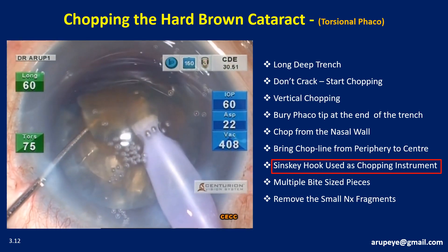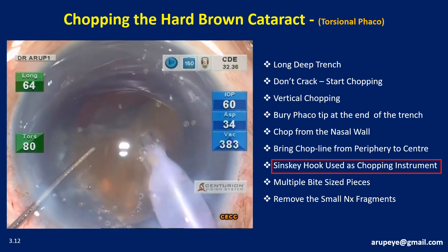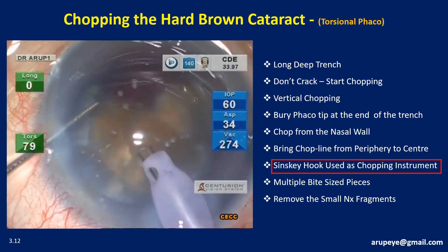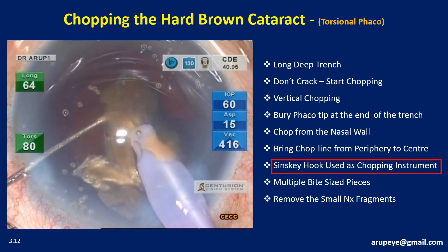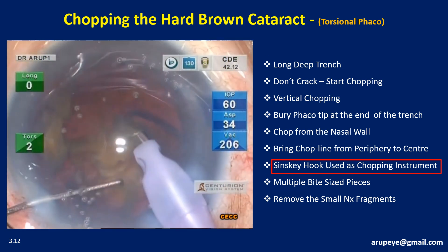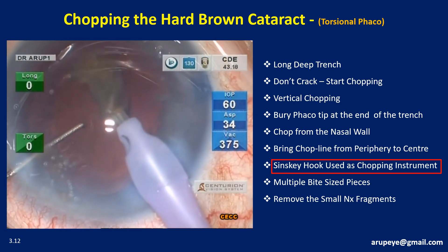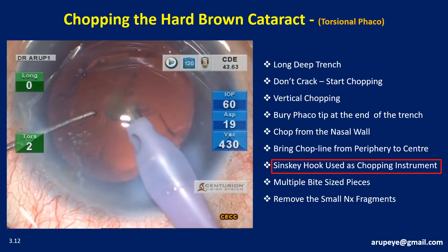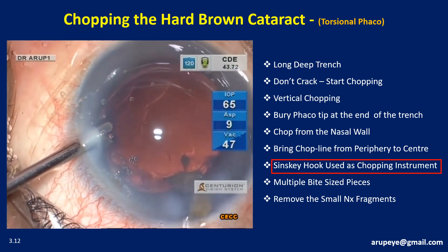The nuclear fragments are then consumed. It is desirable to have the nucleus downsized into multiple pieces — harder and larger the nucleus, smaller the pieces. One has to guard against post-occlusion surge, though with higher-end machines this is rare. The Szynski hook in the left hand manipulates the fragments and guides them towards the phaco tip. Frequent dispersive OVD replenishment will keep the cornea clear on the first post-operative day. Throughout the surgery, just a Szynski hook was used to manipulate the nucleus at various stages of nucleus disassembly.